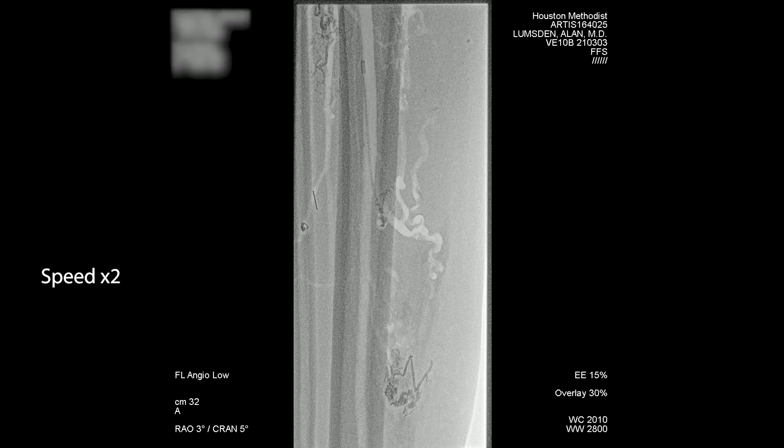You're either going to have to stop, try to reposition the microcatheter, let this solidify, fill up that little aneurysm, and then try to pass the catheter more distally. Good things happen slowly when you're treating these — a little bit of time. Bad things happen fast. I end when I feel the next injection is going to start to get unsafe. It's always the last injection, the one where you've done most of it and you're just trying to top it off, because that's when you're getting back towards the axial circulation, and that's when either a coil launches or it's a big deal.